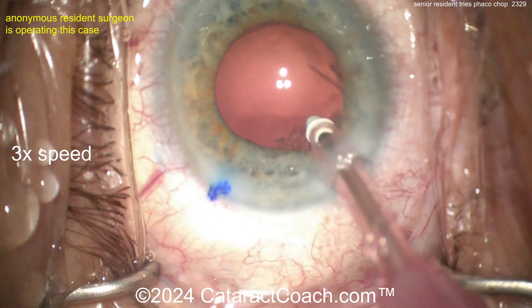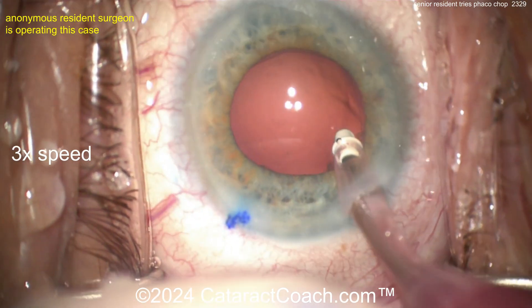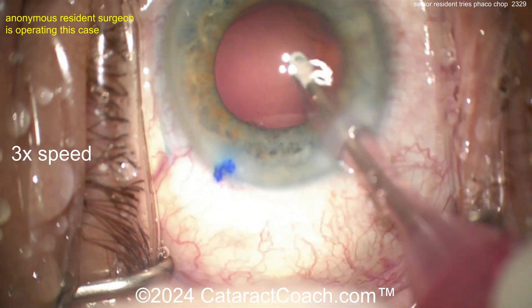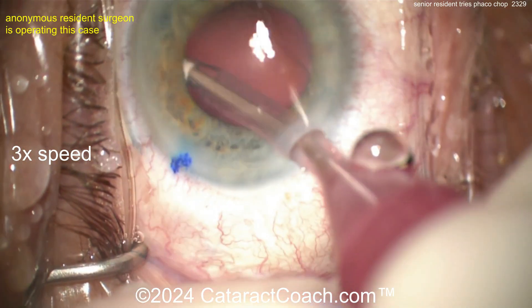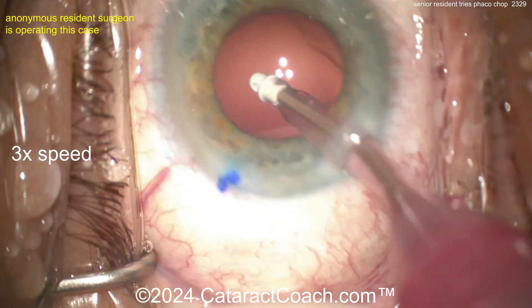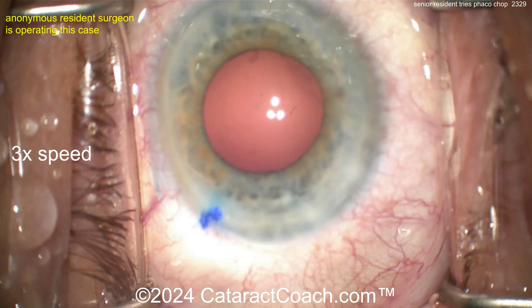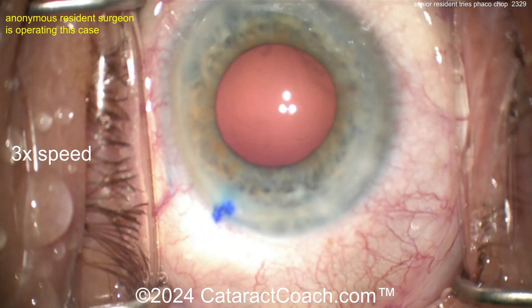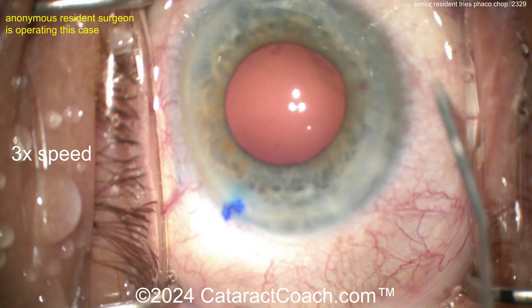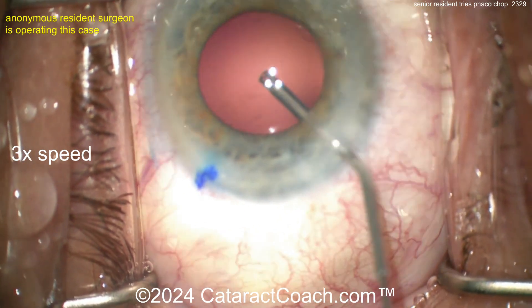I'm on a mission to teach the entire world to do better cataract surgery — it's a big goal and we're working hard. Back to our case: cleaning up that lens cortical material, making sure there's nothing under the anterior capsule. Rotate around a little bit, clear up any cortex that's there — stir it up, don't want to leave anything in the eye.